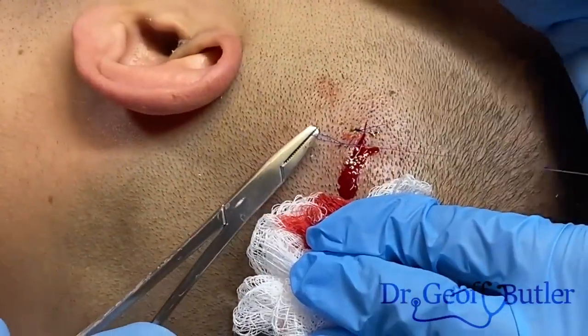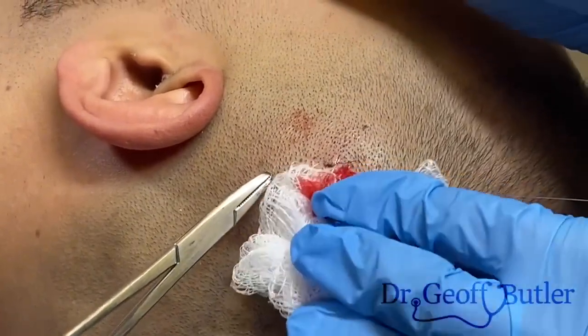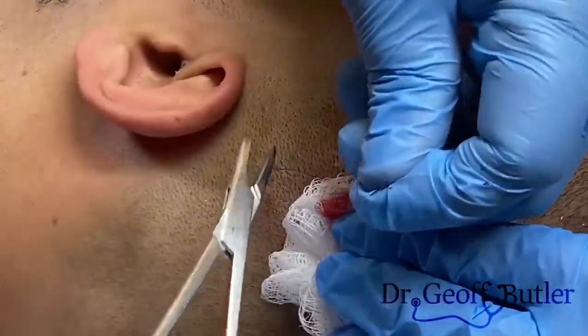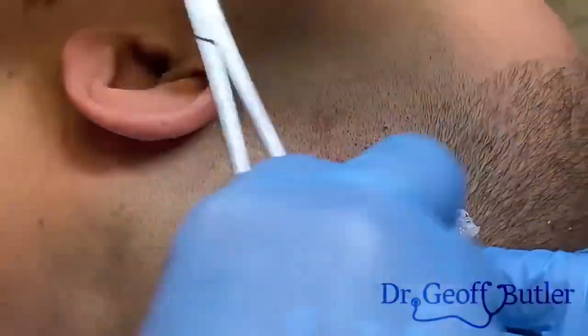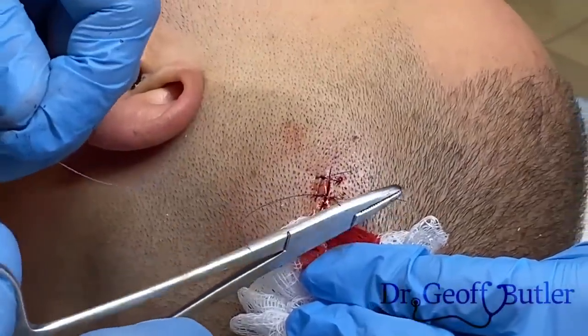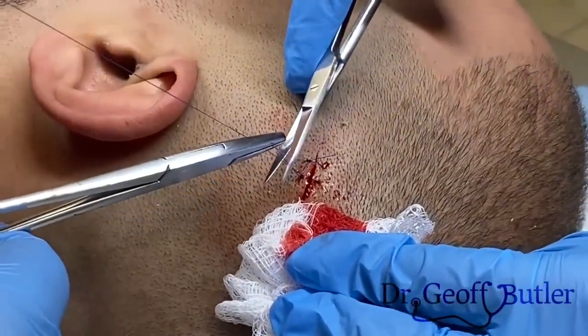So this is still oozing a little bit, why don't we try and cauterize those bleeds? You know the sutures will capture it at some point? Yeah, and what's that process called, where it puts pressure on them? I kind of think it's tamponading.